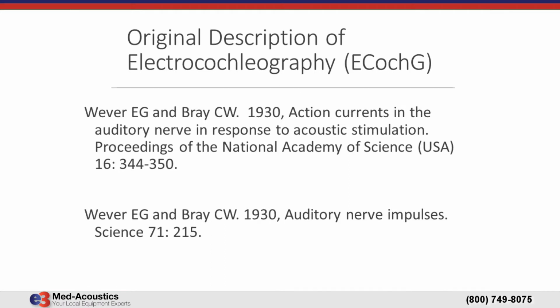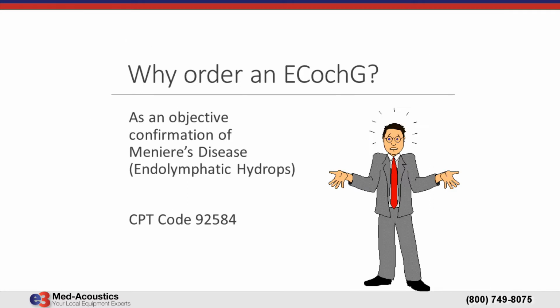Electrocochleography is not a new test. In fact, it's one of the very first tests in auditory evoked potential to be done. You can see here by these two publications as early as 1930. So it's been around for a while.